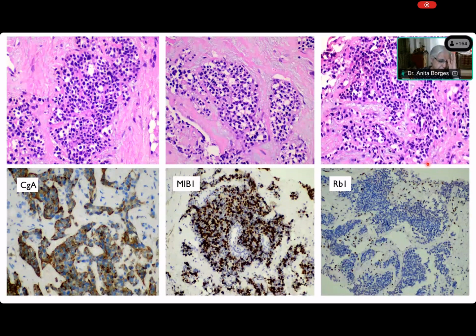And we are now being asked in neuroendocrine tumor pathology to recognize what is well differentiated. And I showed you all those pictures of a well differentiated neuroendocrine tumor from something that is a neuroendocrine carcinoma. Okay, so we have NETs and we have NECs. And the carcinomas have a poorly differentiated morphology. Now, what is this poorly differentiated morphology? It's what is not what we consider well differentiated morphology for neuroendocrine, and we have to recognize well differentiated morphology as what I showed you before. Okay, so it doesn't look like the normal counterpart because the normal counterpart are just single cells, but we have come to recognize what I showed you before as being neuroendocrine morphology.